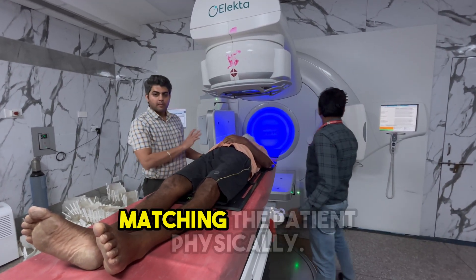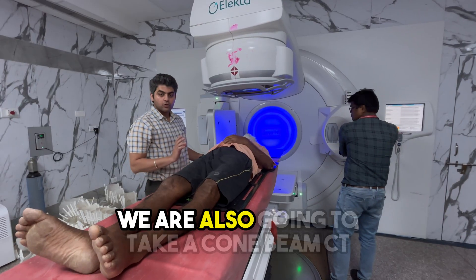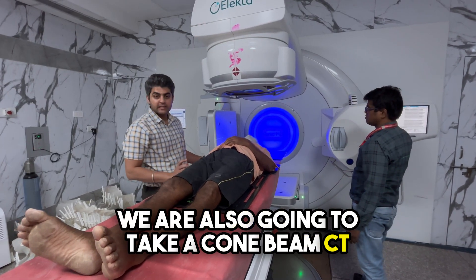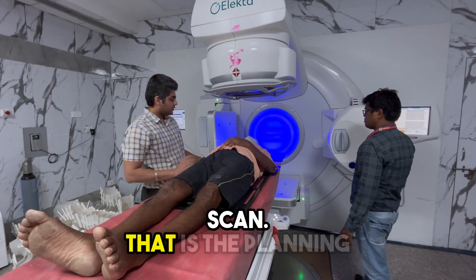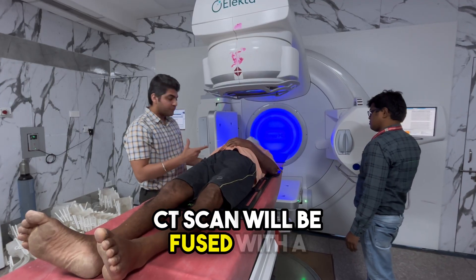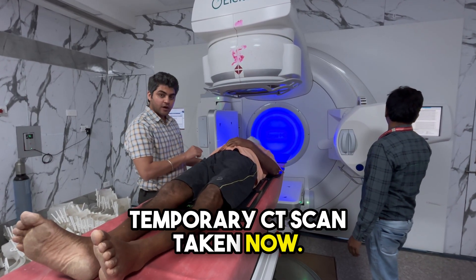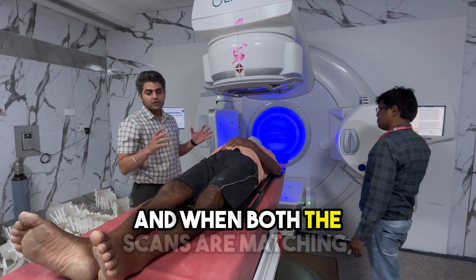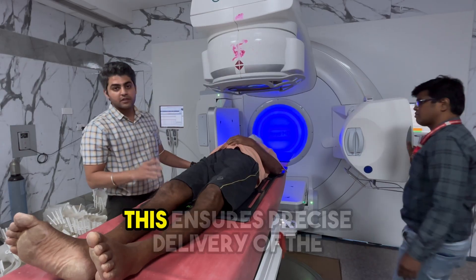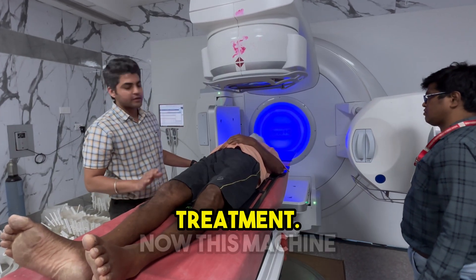So, post matching the patient physically, we are also going to take a cone beam CT scan. The planning CT scan will be fused with a temporary CT scan taken now, and when both the scans are matching, we deliver the treatment to the patient. This ensures precise delivery of the treatment.